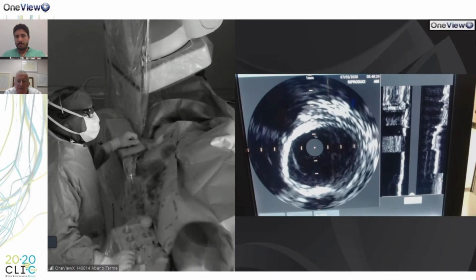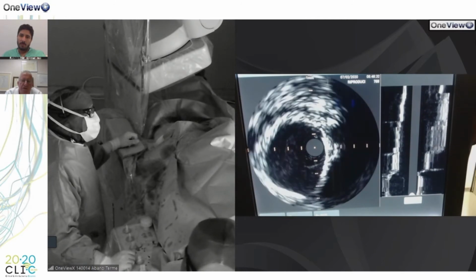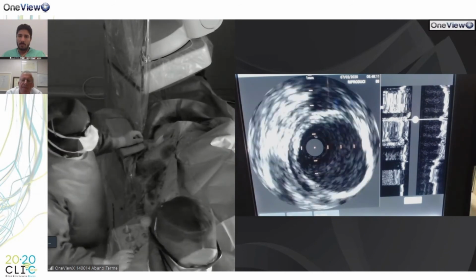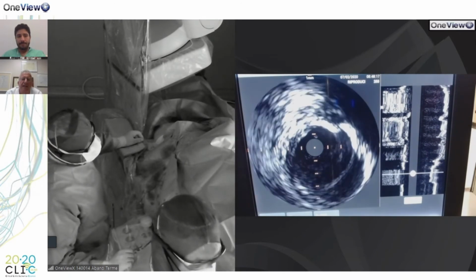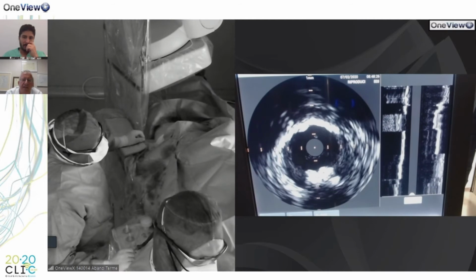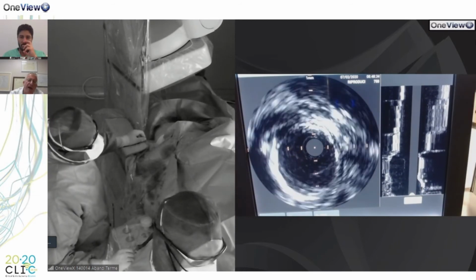In this case, we don't have the angio, the imaging with the angio, to recognize the segment in which we are. It's difficult, but we are 2 centimeters below the needle. Okay. Exactly. Should be the target lesion. You could have the canalization, your main recanalization.